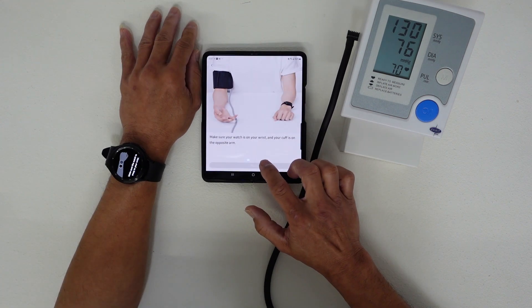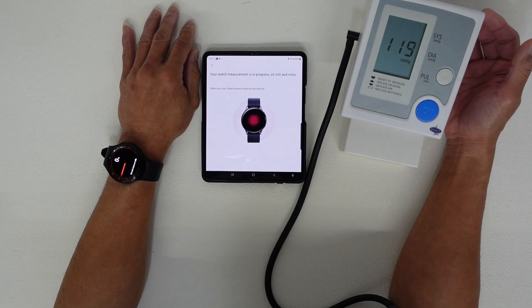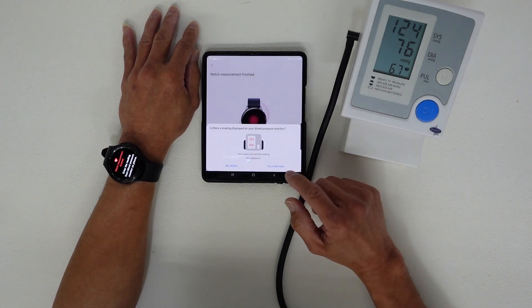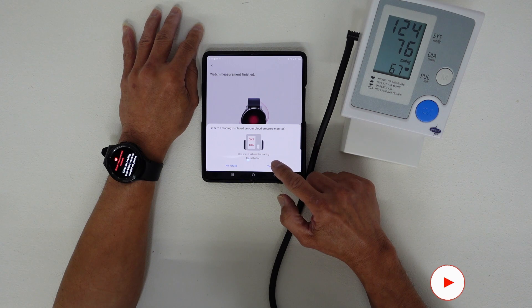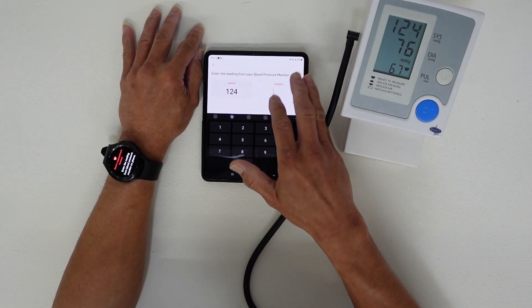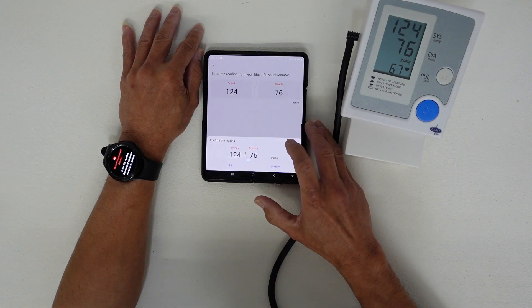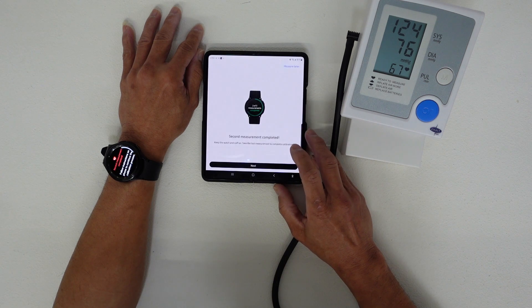For the second measurement, we press Next and start measuring again. The second reading shows my systolic is 124 and the diastolic is 76. We press Done and confirm the reading. That's the second measurement complete.